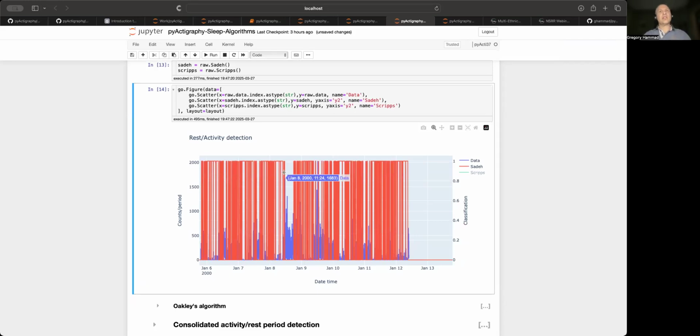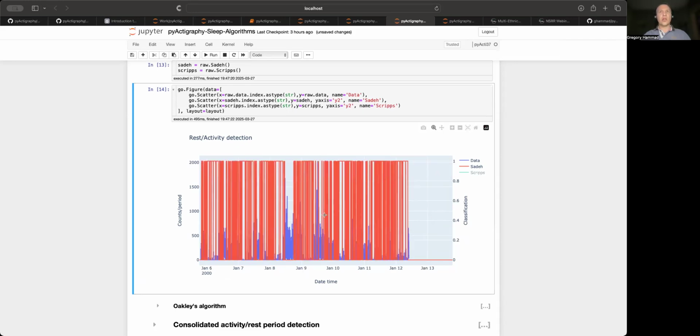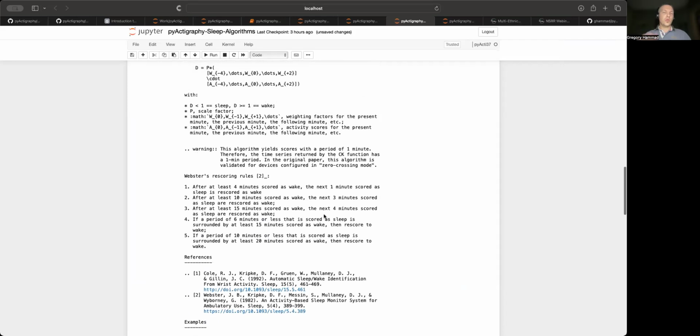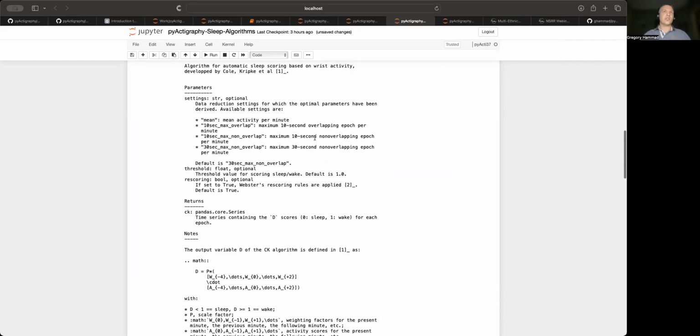It's maybe because for that specific device I had a way to calculate the activity counts, maybe the linearity of it, that is not suitable for that algorithm. Maybe that algorithm is too sensitive, or insensitive, and each time it sees something a bit too low, it classifies this as inactivity. I think it's really hard to use those things because they have been validated on different devices. For this one, it's a device that was run on a 1 minute period.